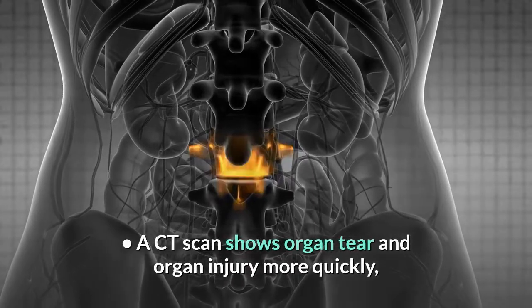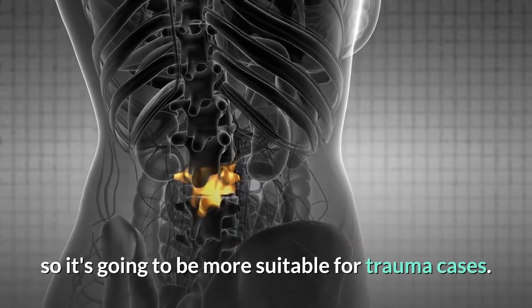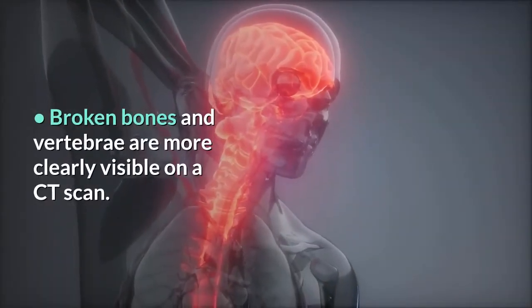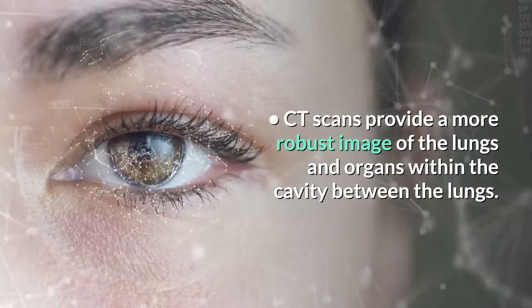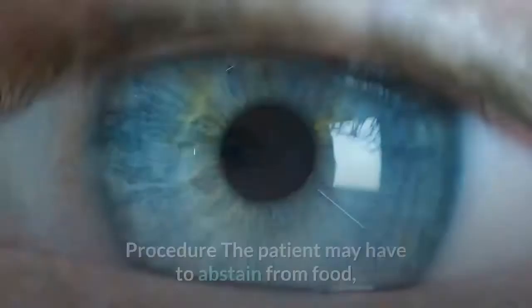A CT scan shows organ tear and organ injury more quickly, so it may be more suitable for trauma cases. Broken bones and vertebrae are more clearly visible on a CT scan. CT scans provide a more robust image of the lungs and organs within the cavity between the lungs.